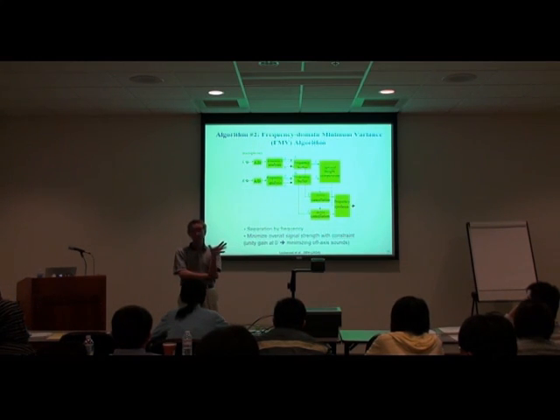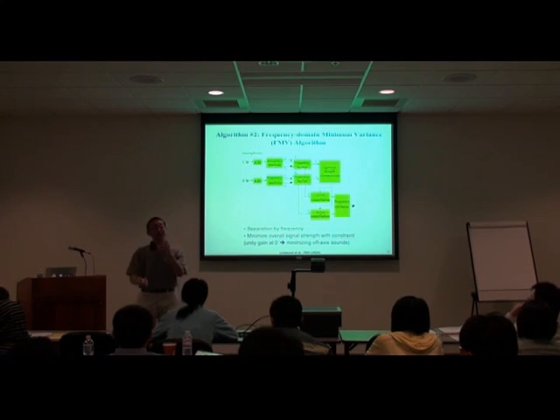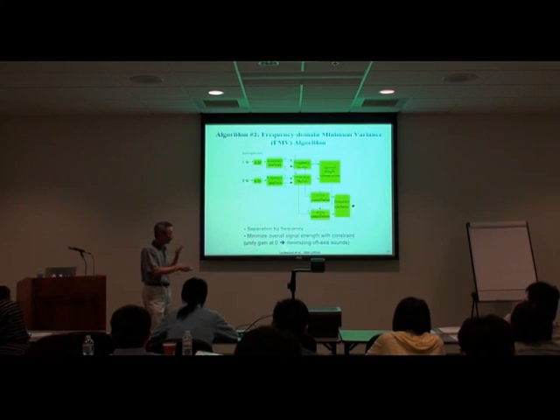Remember I said in the first talk, animals can communicate visually or auditorily. And in fact, most people with hearing deficits use their eyes to do lip reading to assist them to hear. So for them, because they're so accustomed to hearing deficit, the 0 degree becomes a target. So for the ease of the hearing aid user to use a new type of hearing, we decided we're just going to make it simple at the beginning.